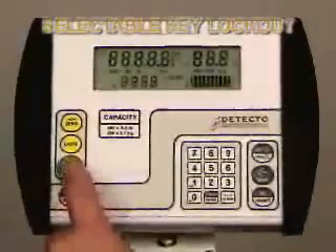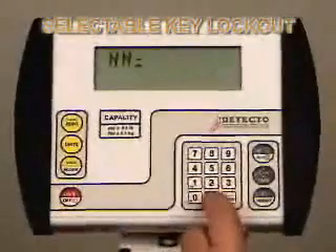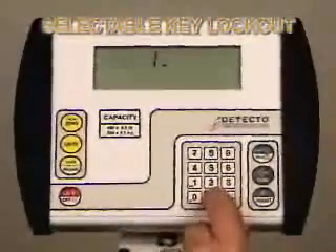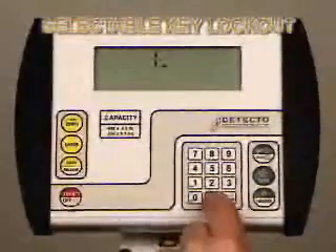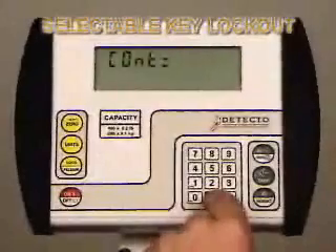With the 758C, you can disable keys you don't want to use. Power on the 758C and immediately press and hold the lock release key until it displays setup on the indicator. Once in setup mode, press the Enter key until you get to the BTN setting.